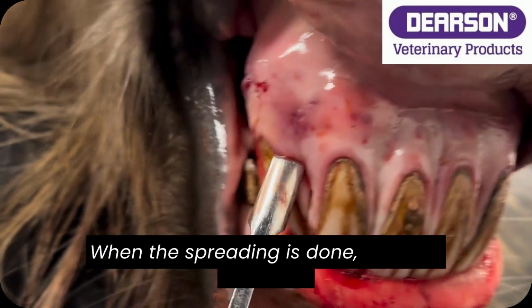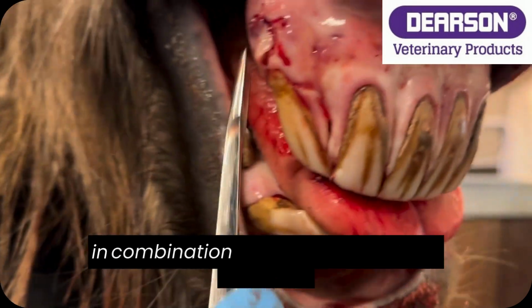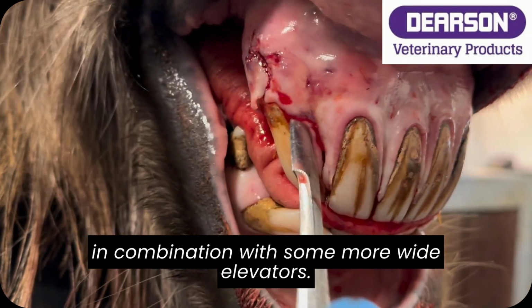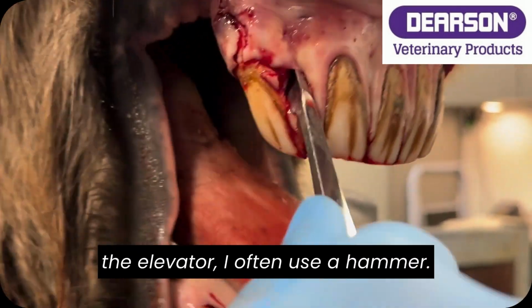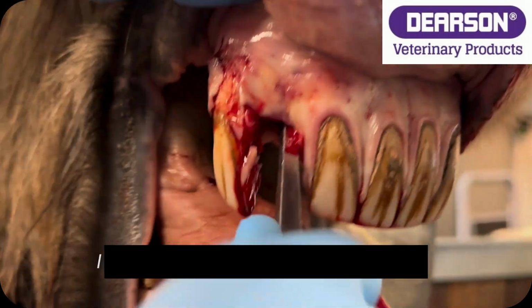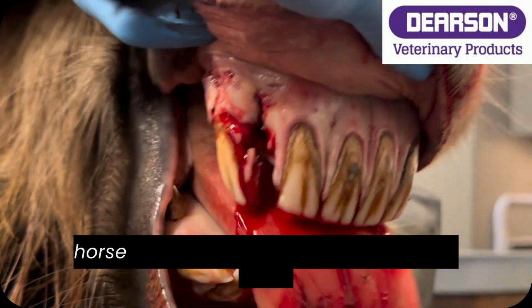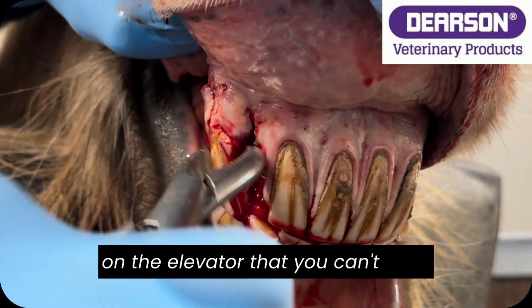When the spreading is done, I use my elevators. I normally use my wolf tooth elevators in combination with some more wide elevators. And instead of just putting pressure on the elevator, I often use a hammer. The hammer just makes the elevation procedure easier, and I consider it to be more safe if the horse moves its head, as you don't have force on the elevator that you can't stop.